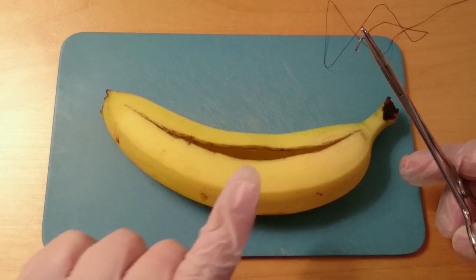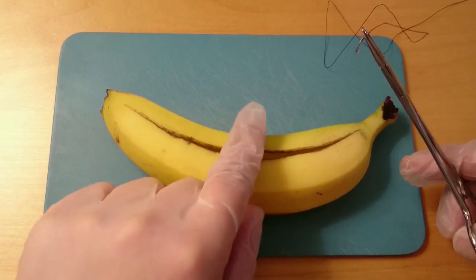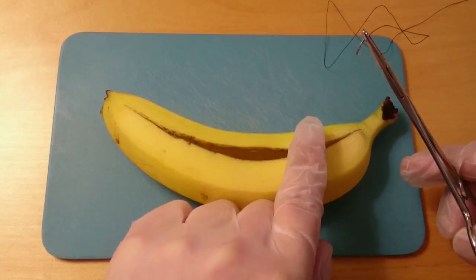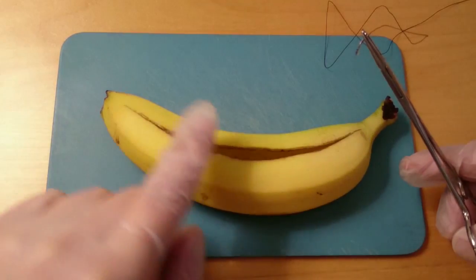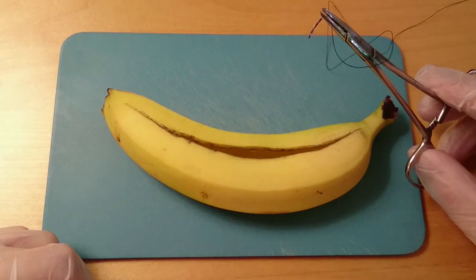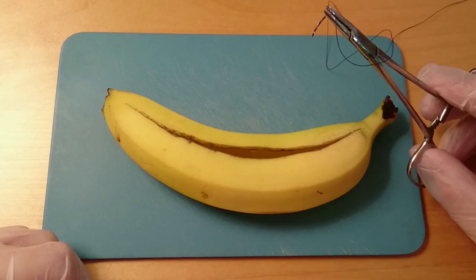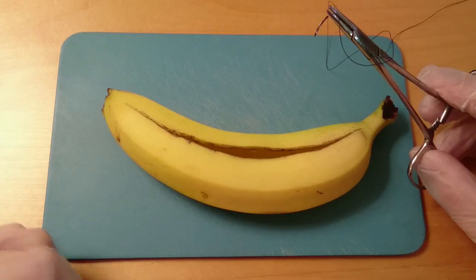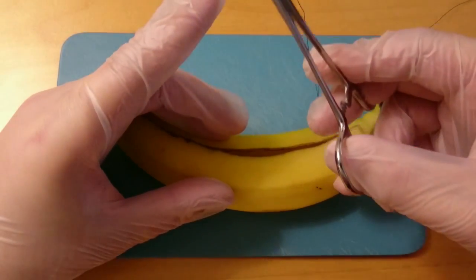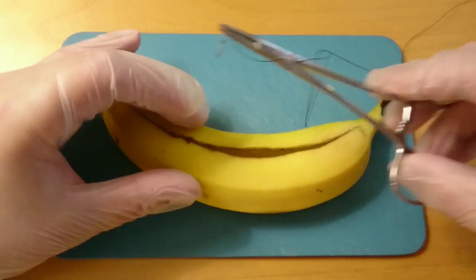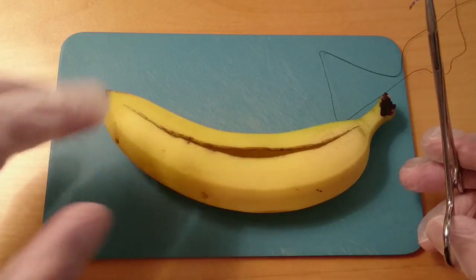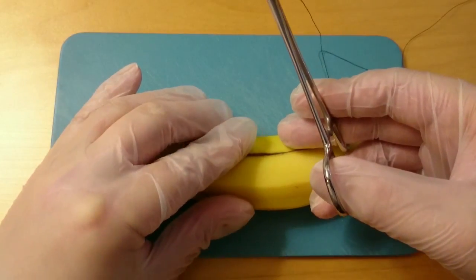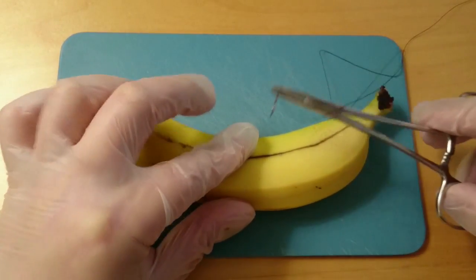When suturing, you always start suturing at the middle of the wound, then half, half, half. A tip while suturing is always keeping contact with the patient. For example, you have a finger down on the patient. Starting with placing the wound in a good position, and we start in the middle.